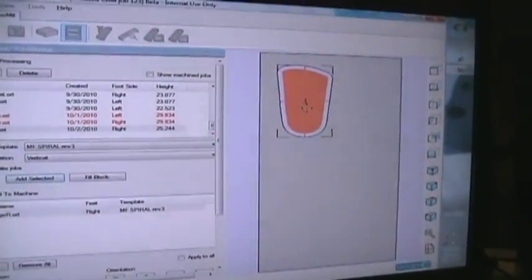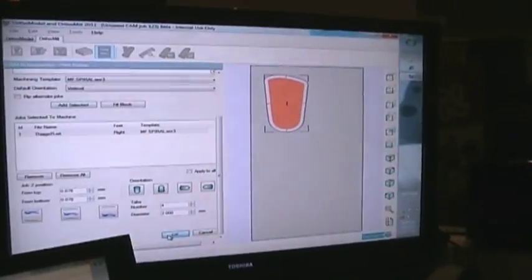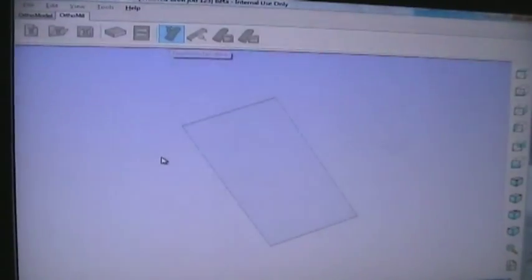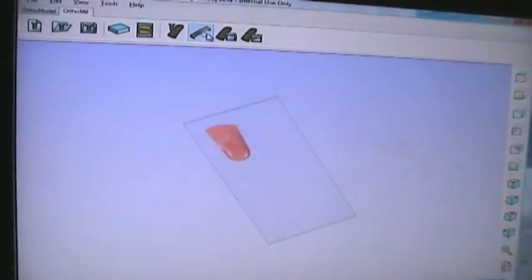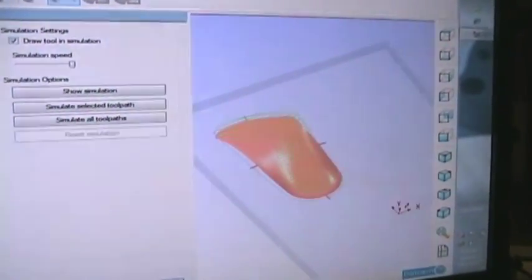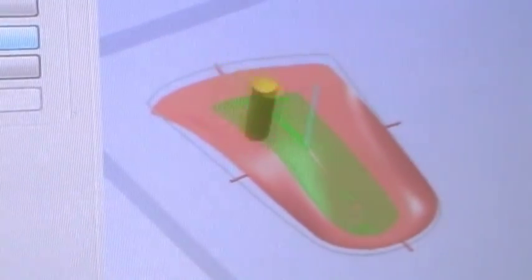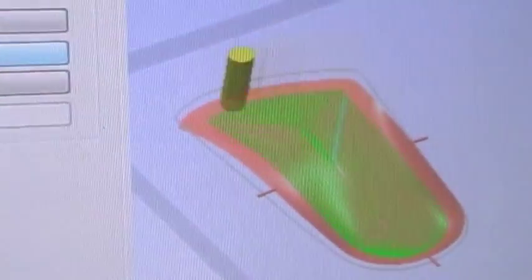Does that rectangle represent the block of material? Yes. Once I'm happy with the position of the orthotic, I select OK. OrthoMil then starts calculating the tool paths — how the tool is going to cut the block placed into the FMT machine. In this example, we're using a spiral toolpath that follows exactly the shape of the orthotic. If you select simulate selected toolpath, you can clearly see how the tool is going to cut the orthotic — including the top toolpath, the bottom toolpath, and the cut-out toolpath to trim the orthotic out of the block automatically.